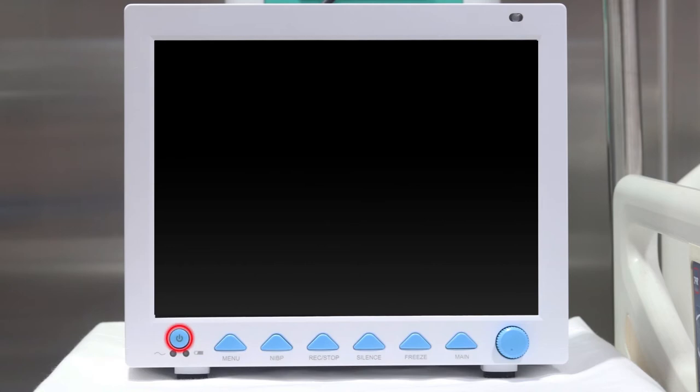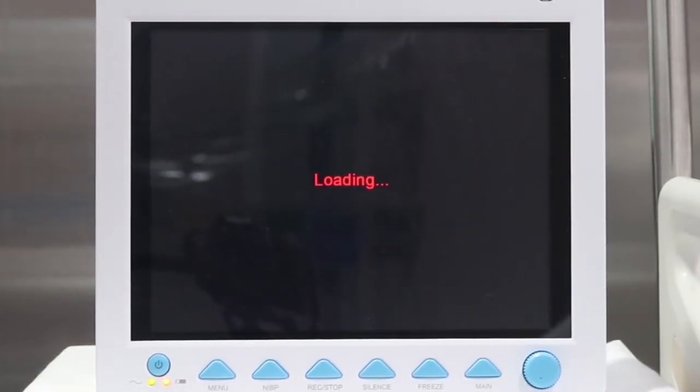Press the power button to turn the monitor on. A beep will be heard and simultaneously the indicator will flash once in orange. The system initializes and you get a display on the screen.